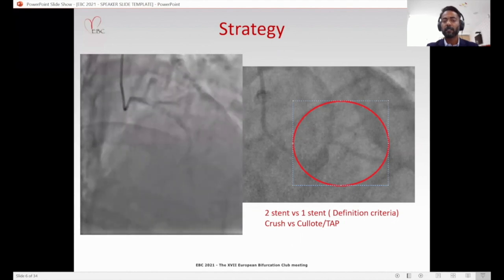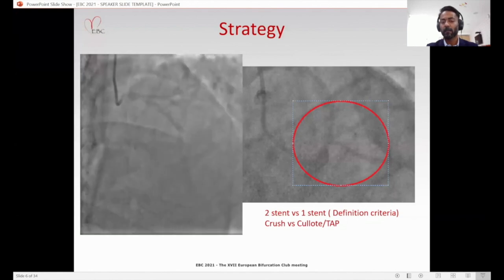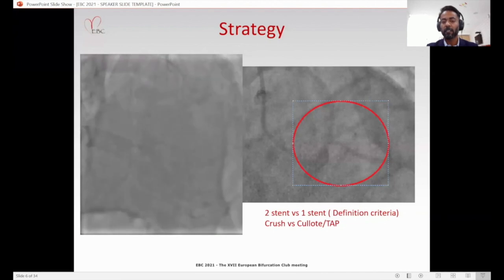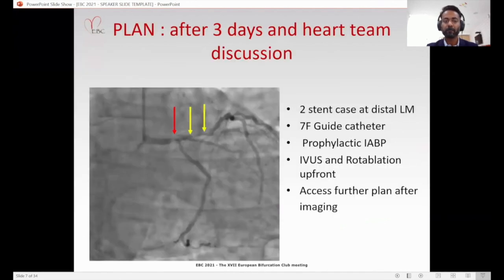For PCI, first we needed to decide the best strategy for the distal left main. Here we thought it was a Medina 111 lesion with heavy calcification and long segment disease of the circumflex. So we decided to treat with an upfront two stent strategy for the left main. We decided to use a 7-French guiding catheter and insert a prophylactic IABP from the left groin, as we did not have Impella at our institution, and to do the procedure under imaging guidance with rotablator upfront, considering the long diffuse segment disease, which was heavily calcified in the LAD.